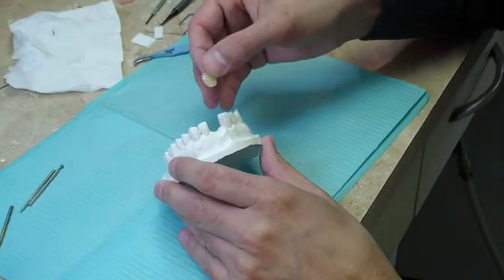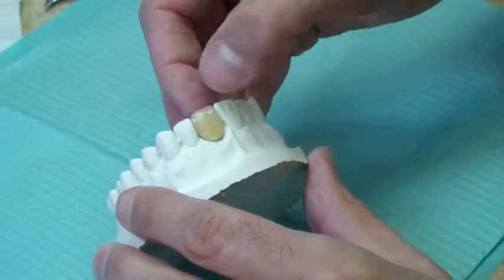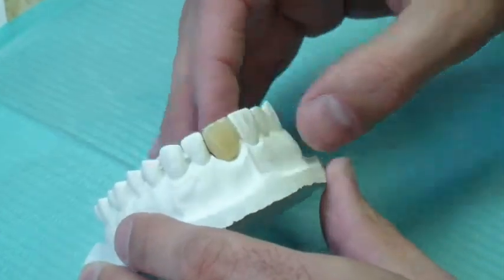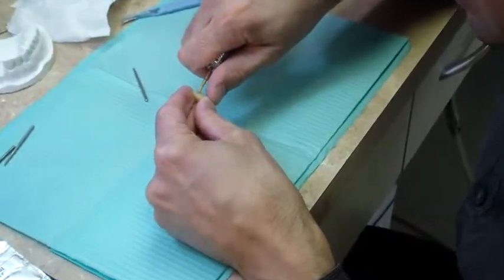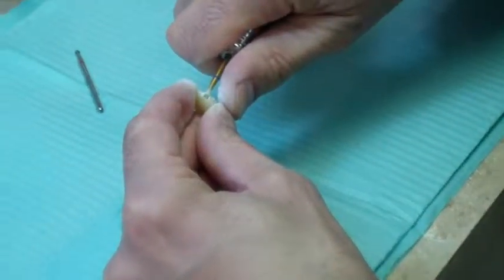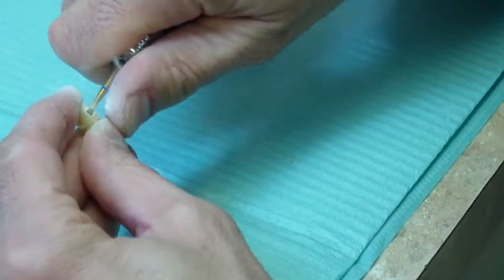Begin by selecting the appropriate denture tooth and adjust it to fit the pontic space on the model. Cut a horizontal channel on the lingual side of the denture tooth. Ensure that the space is approximately 3mm deep and has a retentive form.